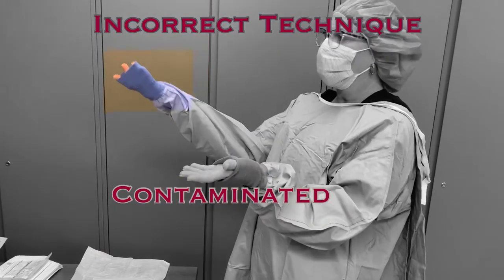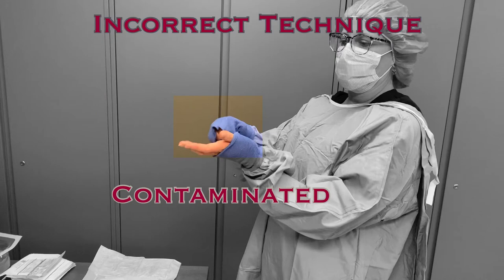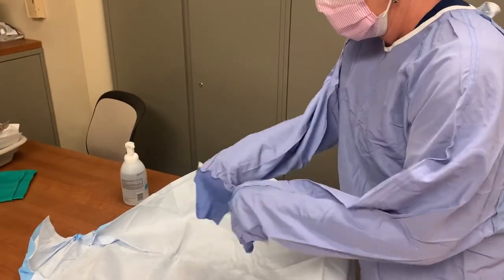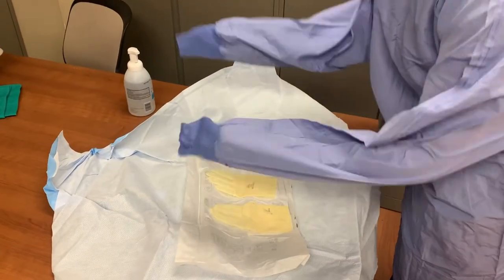Do NOT grasp the cuff at the end and pull the sleeve over your hand — the sterile sleeve WILL come in contact with your non-sterile hand, and you will need to start over with new supplies. With both hands still contained within the gown, go to your sterile gloves. Open the package and lay it out on the sterile field. Because your hands are still within the gown, you can manipulate sterile supplies within this field freely.